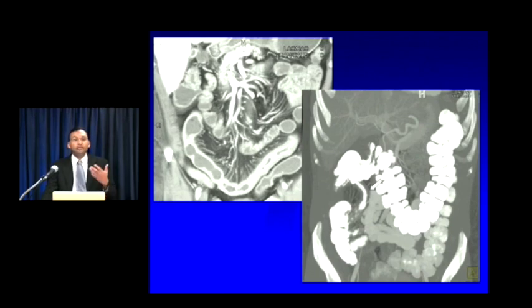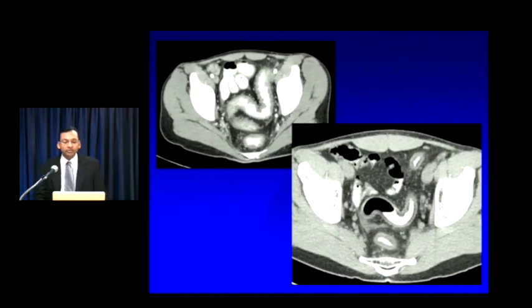Crohn's disease, you're looking for thickening, hyperenhancement, classically the distal small bowel extending into the terminal ileum, engorgement of the vasa recta. Ulcerative colitis, you're looking for wall thickening extending proximally from the rectum. No skip lesions, tends to be relatively contiguous.